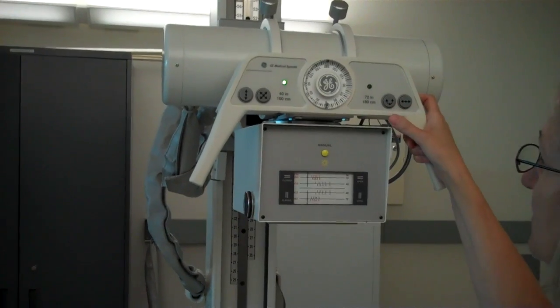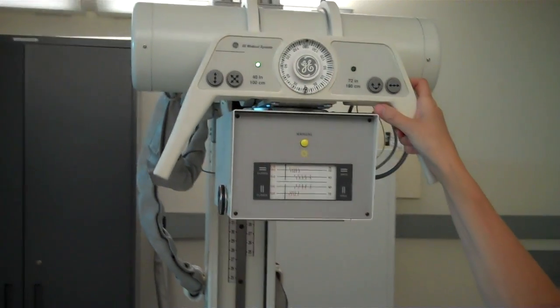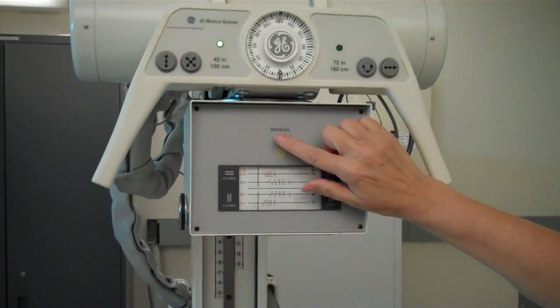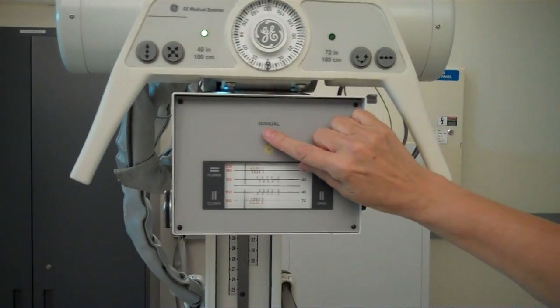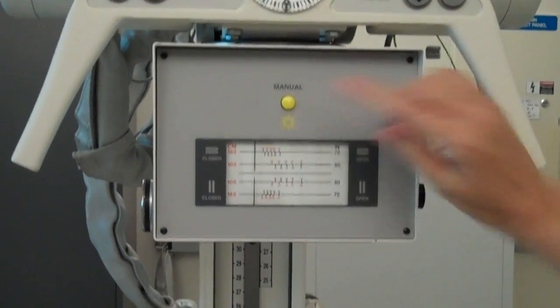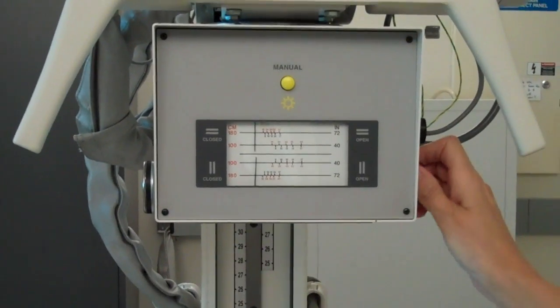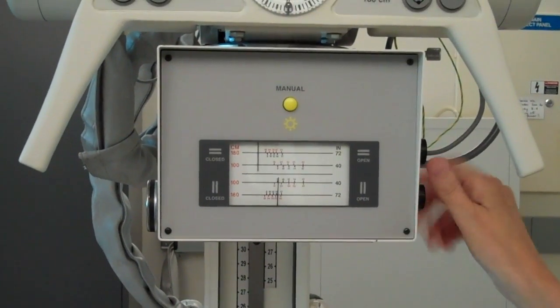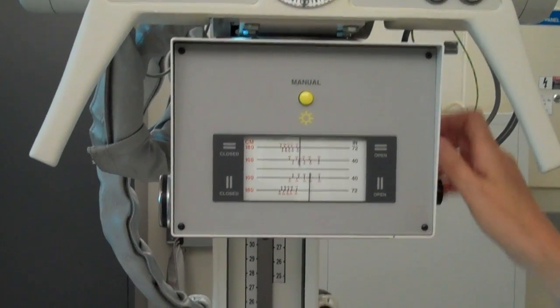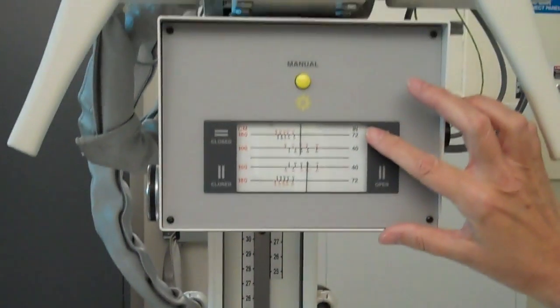To see where the x-ray field is, we have a light. It is manual. When you select it, the light field becomes visible on the table or on the patient or phantom. There are numbers involved for 40 inch SIDs and 72 inch SIDs.